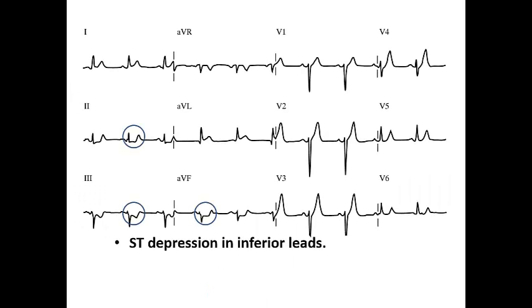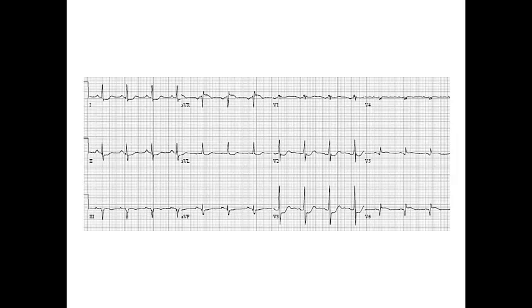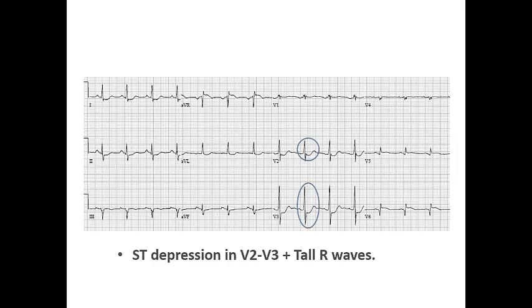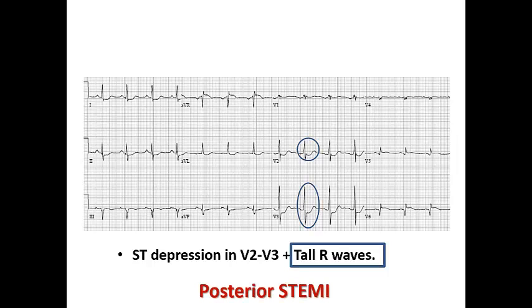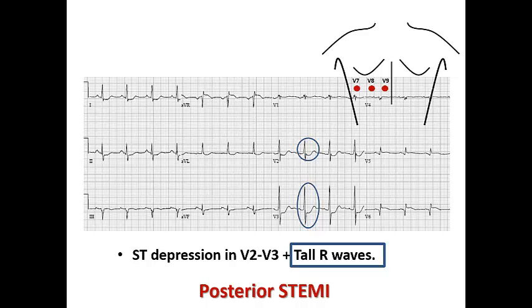Here, the patient has ST depression in inferior leads but ST elevation in lateral leads — so it is high lateral STEMI. In another ECG we can see ST depression in V2 and V3 with a tall R-wave and possibly prolonged R-wave duration — this is posterior STEMI, not non-ST. Performing posterior ECG leads would show ST elevation of ≥0.5 mm.